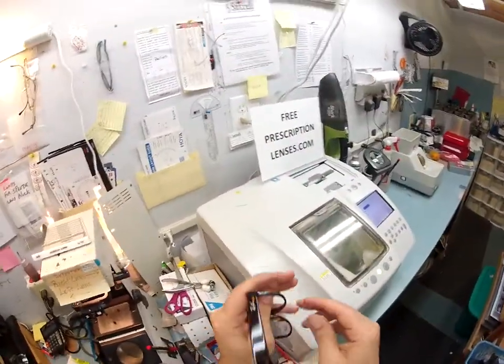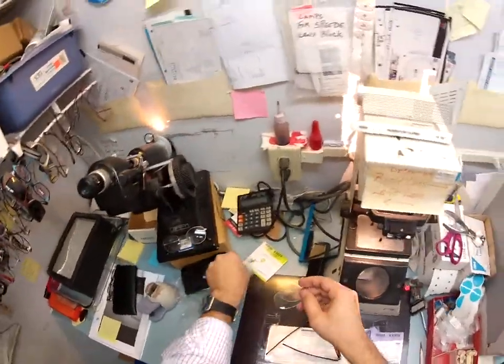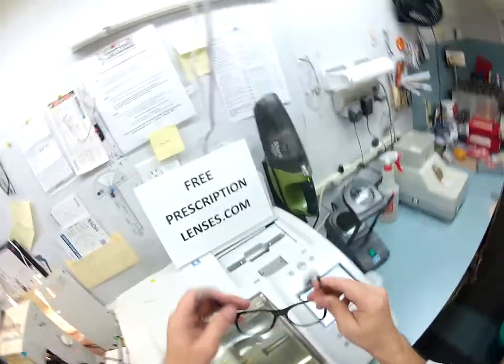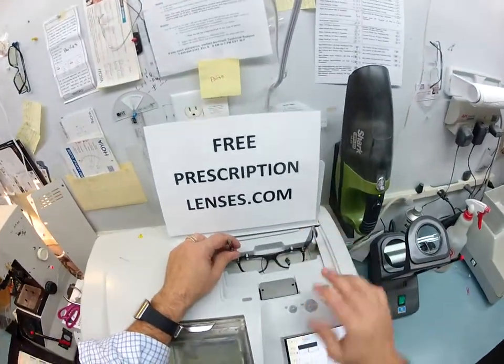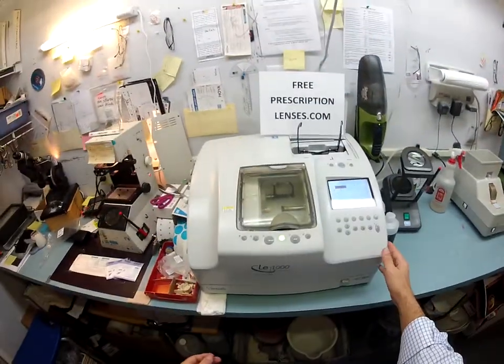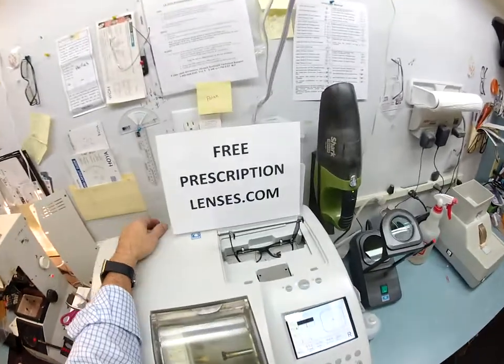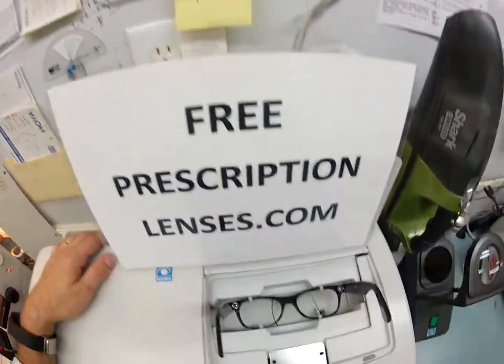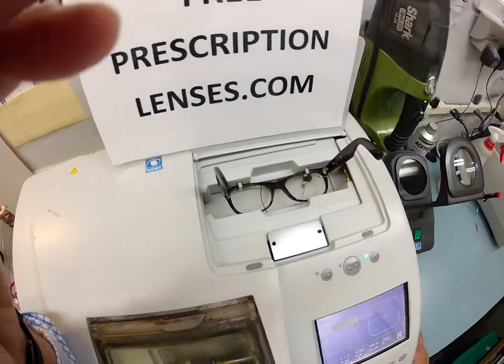First things first, let me take these clear demo lenses — Coquille as they used to be called in the old days — and pop those out. I'm going to put these in your bag because I'm shipping you everything, all the original packaging. I'm going to put your frame into my Santanelli LE 1000 patternless edger here at freeprescriptionlenses.com, where everyone loves a bargain and no one is disappointed with quality.